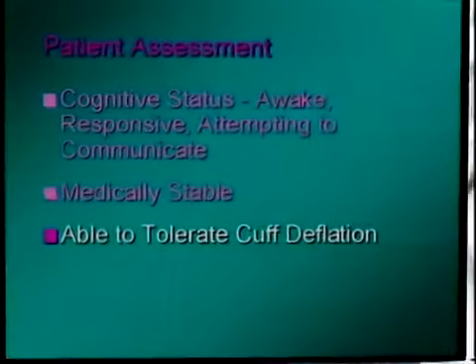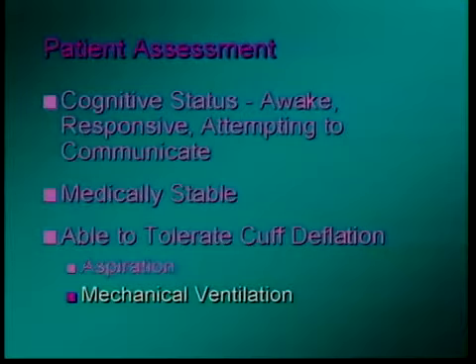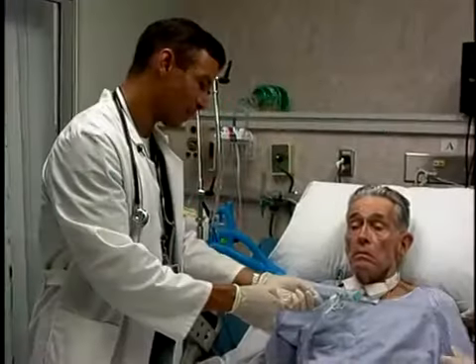It is vital that the valve be made available to these patients as soon as possible post-tracheotomy to enable them to direct their care, provide informed consent, and communicate with their loved ones. Cuff deflation is mandatory when utilizing the PMV in order to allow expired air to pass around the tracheostomy tube and through the oronasal pharynx.